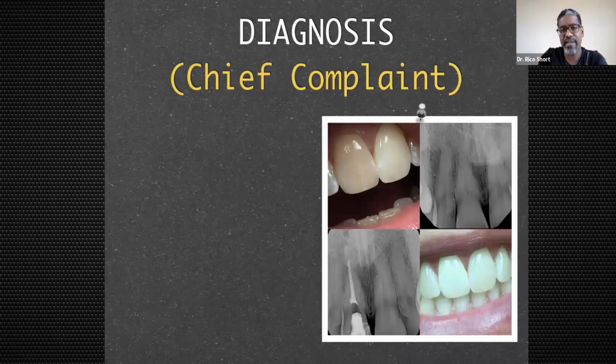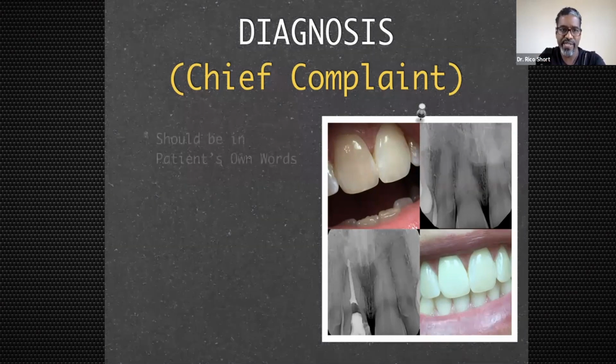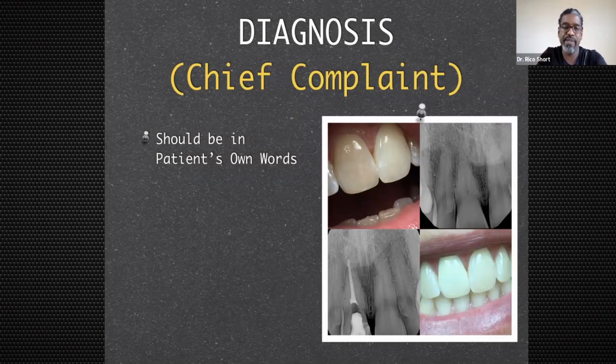This patient came in and her chief complaint was that her front tooth was dark. She had a history of a trauma and she thought, well, maybe I can just bleach the tooth and it'll be fine. Well, we did pulp testing and the pulp ended up being necrotic. So we had to do endo, and I had to explain to her we had to do endo on the tooth, but we can internally bleach it. And so that's what we were able to do. So we did endo on this case and was able to internally bleach it. And everything went really well on her case.